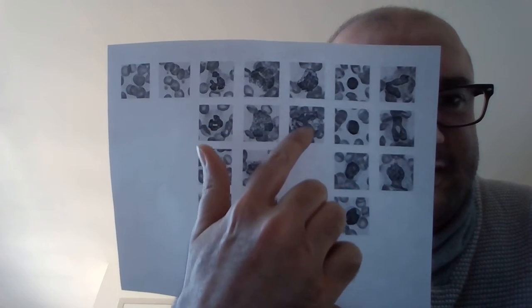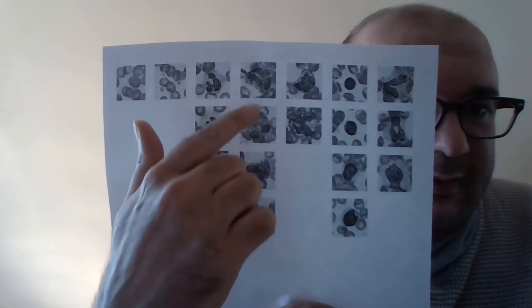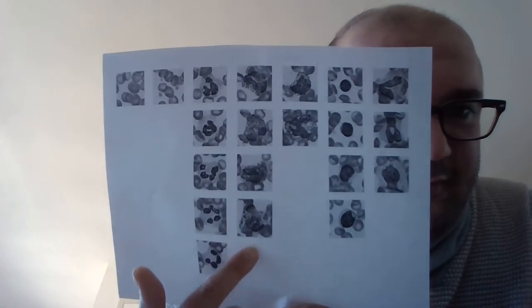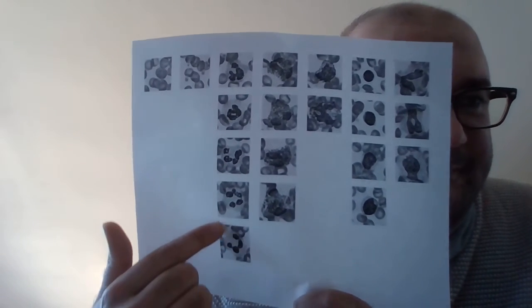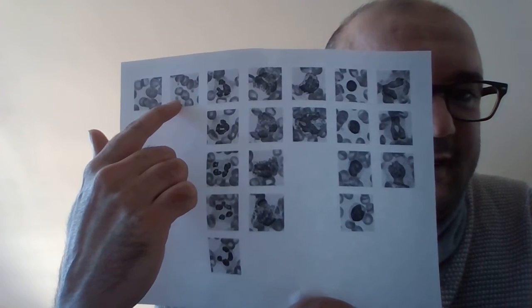Basophils, we can see like this. Eosinophils, we can see like this. It's very useful for fighting against parasites in our body. And this one is neutrophils. And the small one, platelets, and then red blood cells.